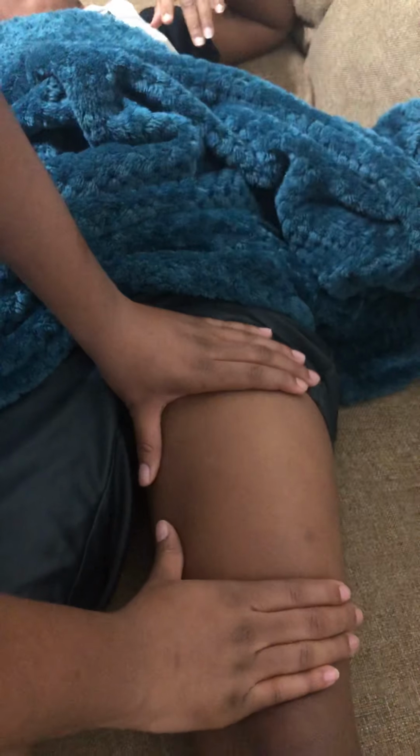For the intramuscular injection, it's usually preferred to do it in the 1/3 of the space that you have, and you will clean it with the alcohol pad, and then inject it at a 90-degree angle. For the subcutaneous injection, the subcutaneous tissue is found as a layer over the thigh, called the anterior thigh. You will give it at a 45-degree angle or 90-degree angle on the other 2/3 part of this area, making sure you don't go above or away from the midline of the leg. Now this concludes the demonstration part of the video.